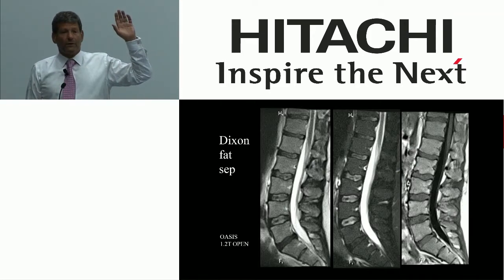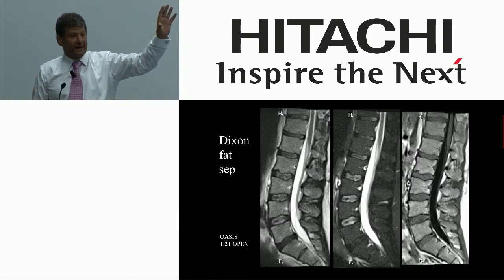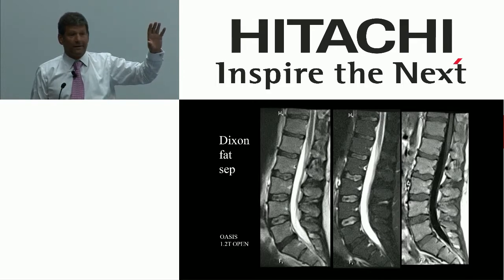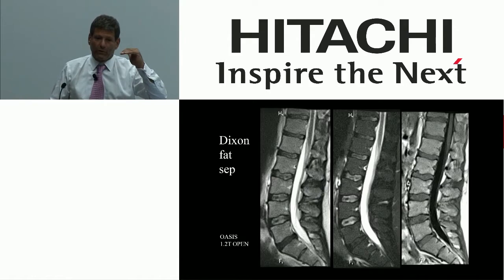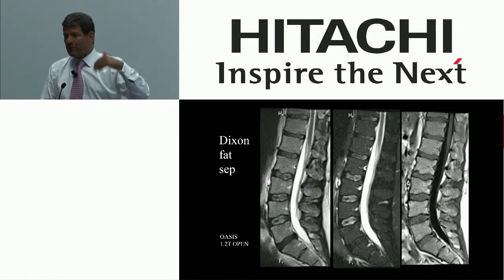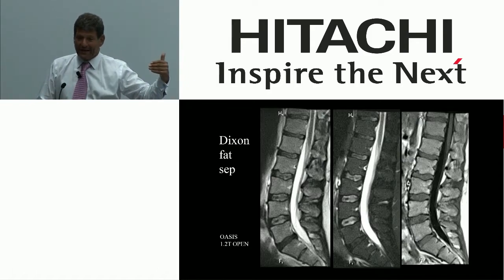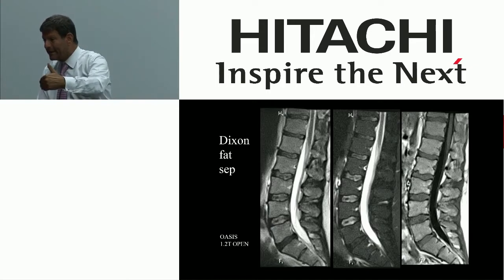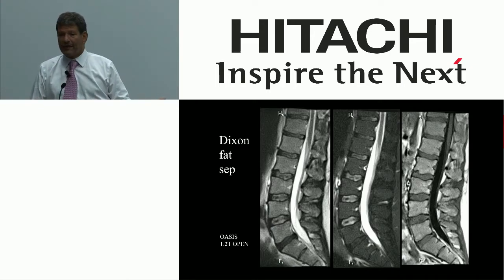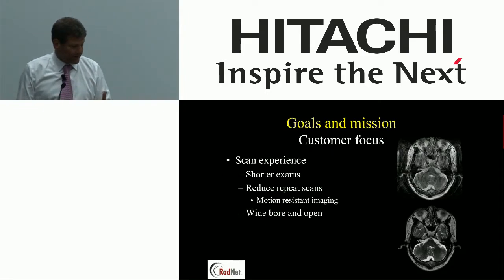Some people do. Technologists in the room, have you ever had a place that needed to do a T1 fat sat and a T1 without fat sat pre-contrast? Okay, that's a lot of time with very little value. Imagine you can get that done with one shot. Same thing with the post-contrast scans. Some guys are fighting, they don't like the fat sat, some people do like the fat sat. I love fat sat, the surgeons generally don't. Two for one, it's a beautiful thing, everybody's happy. Can't get that every day, but this is an innovative technique that makes a difference there.